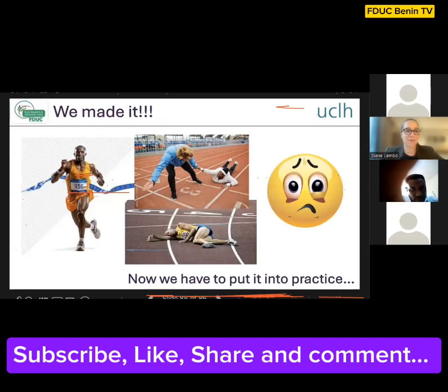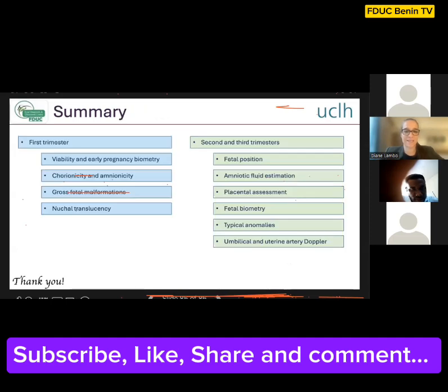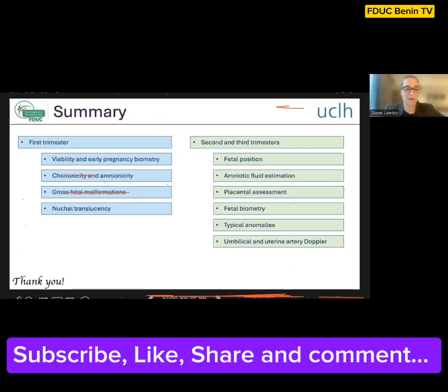It is about scanning, and scanning some more, in order to really apply this theory and understand how it all works. What I hope we've achieved in this lecture is covering really the basic theory between first and third trimester ultrasound, really from top to toe. I'm happy to answer any questions or hand back to Dr. Eager.